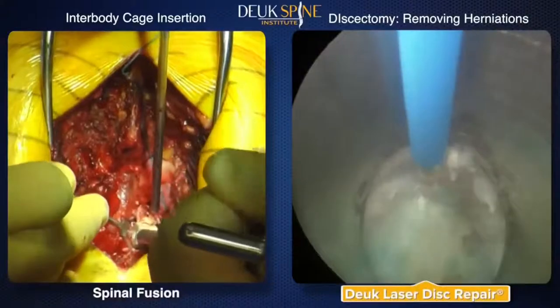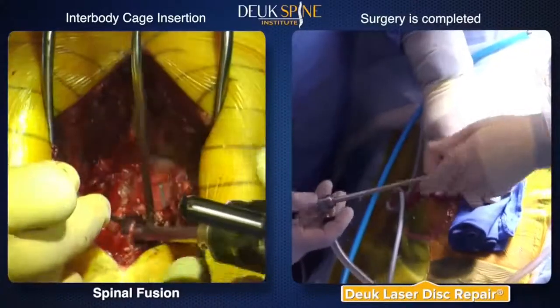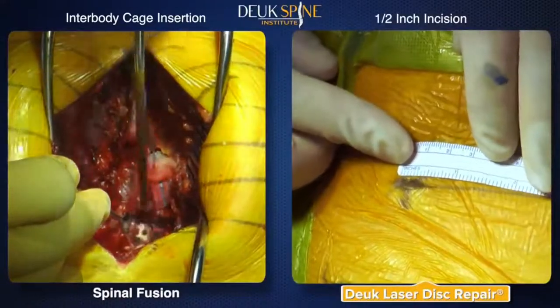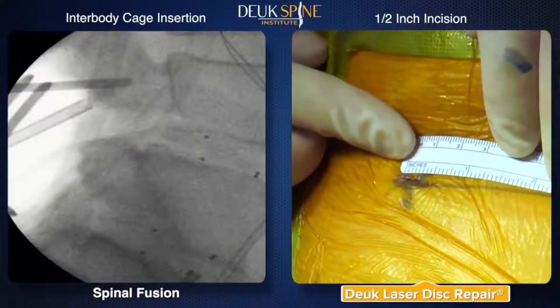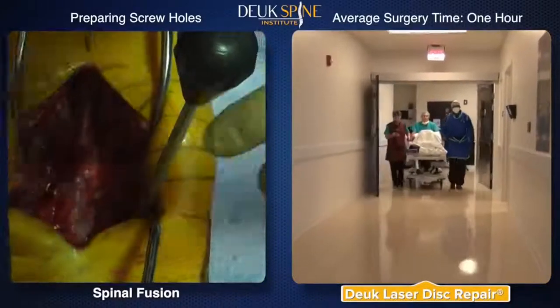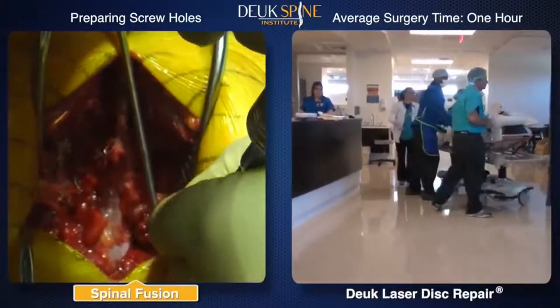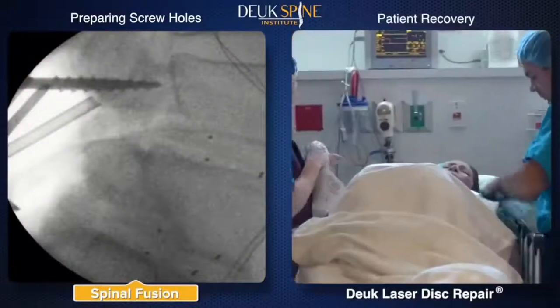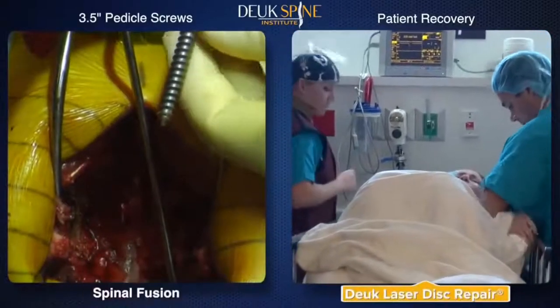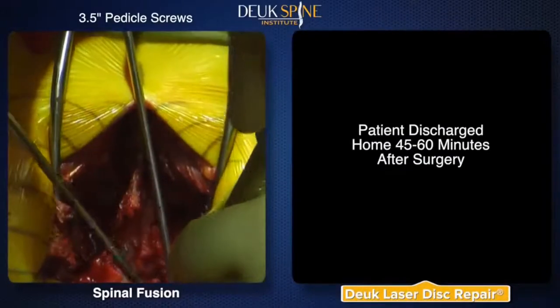Once the laser has removed the painful part of the annular tear, the endoscope and tubular retractor are removed, leaving less than a half inch incision in the skin, which is closed with a single stitch, Steristrips, and a Band-Aid. Total time for the Deuk laser disc repair surgery, approximately 1 hour. The fusion, however, is still underway. Holes in the spine must be tapped in preparation for the large pedicle screws that anchor the fusion hardware. The Deuk laser disc repair patient is in recovery usually 45 to 60 minutes before release to go home.